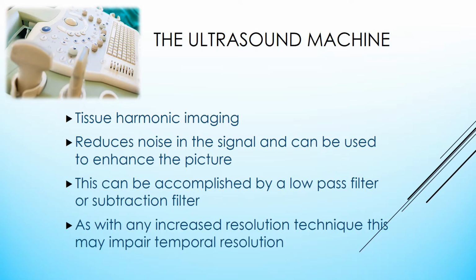Tissue harmonic imaging. This will also reduce noise in the signal and can be used to enhance the picture. This can be accomplished by a low-pass filter or a subtraction filter. As with any increased resolution technique, this may impair the temporal resolution.